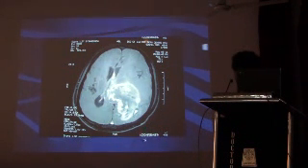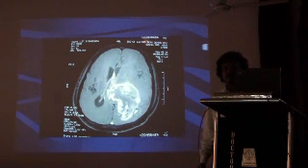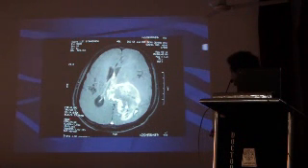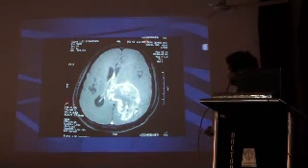So here one thing is written: contrast. After giving contrast, we have delineated a particular lesion. What contrast do we use? We use a paramagnetic substance which is non-toxic to the body, especially gadolinium. Gadolinium DTPA is one of the safest contrasts we use. All these protocols are taken in T1 weighted images, and during that time the TR is slightly increased. And FS means fat saturation sequence image.